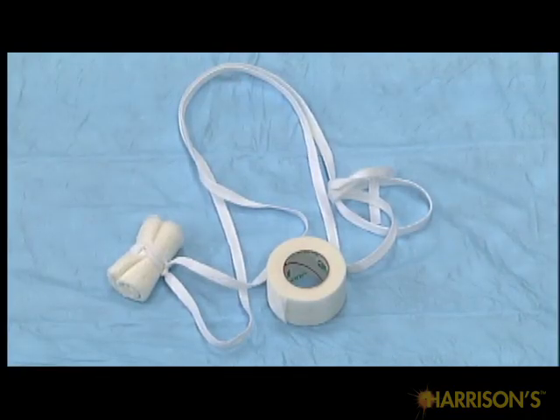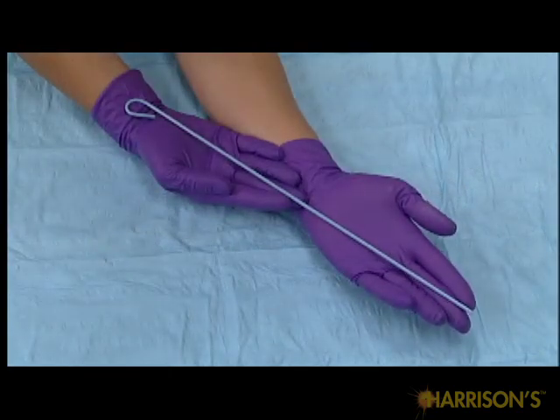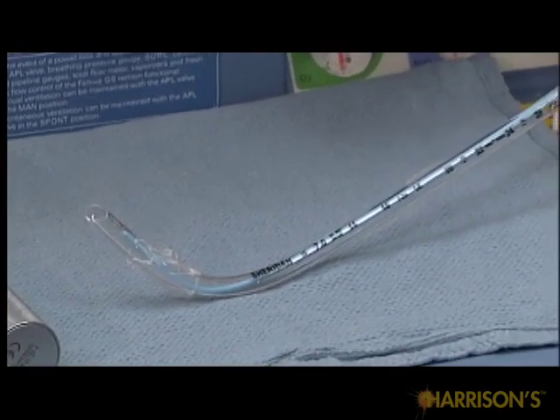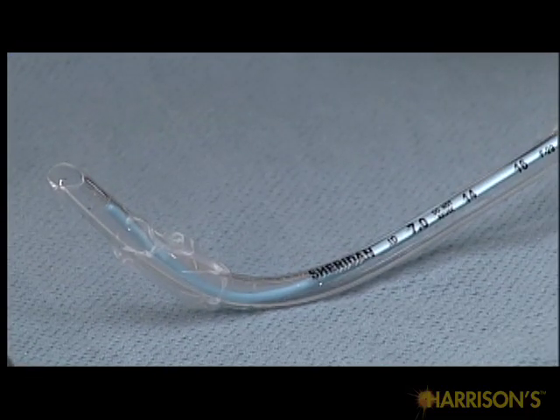tape for securing the tube, LMA in case of inability to ventilate or intubate, one size smaller and one size larger than presumed size, stylet. The stylet should be inserted in the endotracheal tube and bent into a hockey stick shape to facilitate passing the tube through the vocal cords. In addition, it is important to ensure the stylet does not protrude past the end of the endotracheal tube in order to prevent tracheal injury.